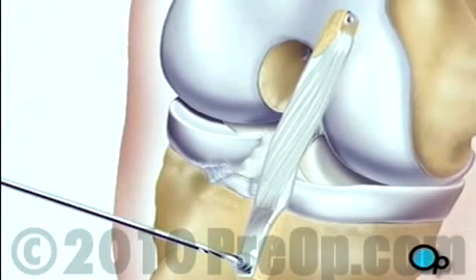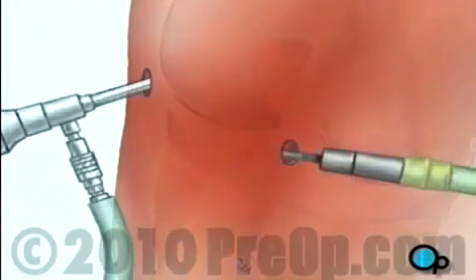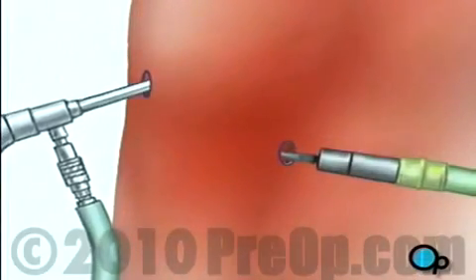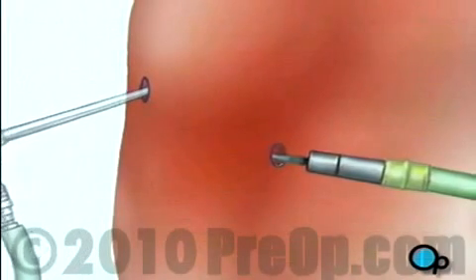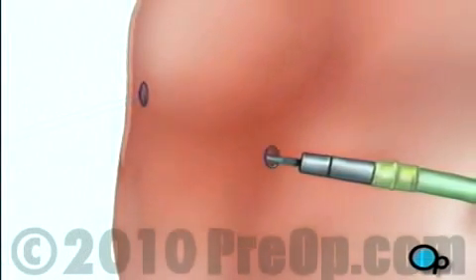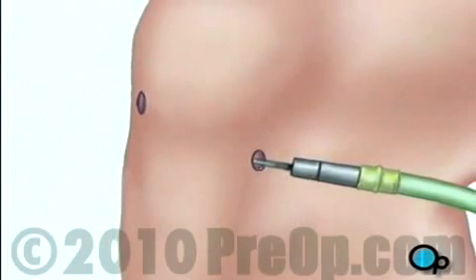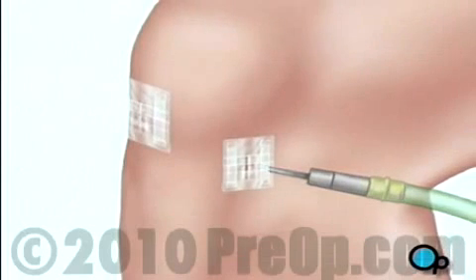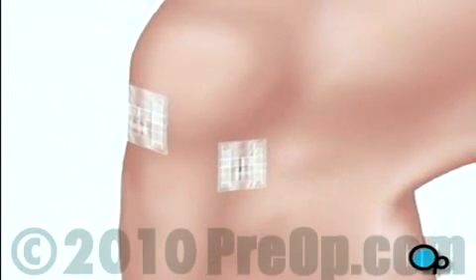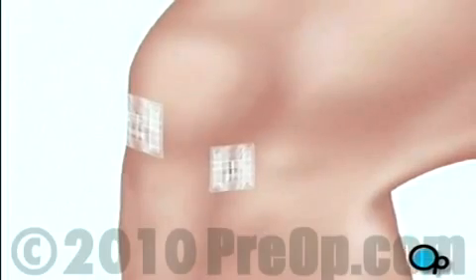When the procedure is complete, the team withdraws the instruments and the surgical fluid drains safely from the knee. Following surgery, sterile dressings are applied. To aid in healing, your knee may be stabilized with a brace, and you'll be encouraged to use crutches during the recovery process.